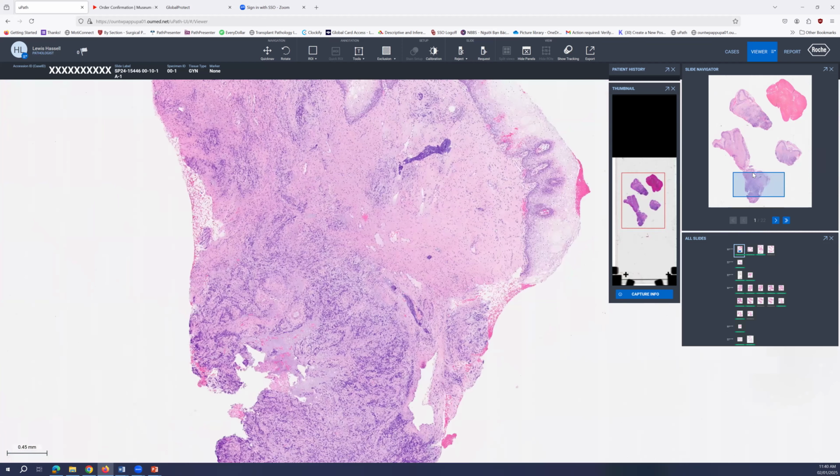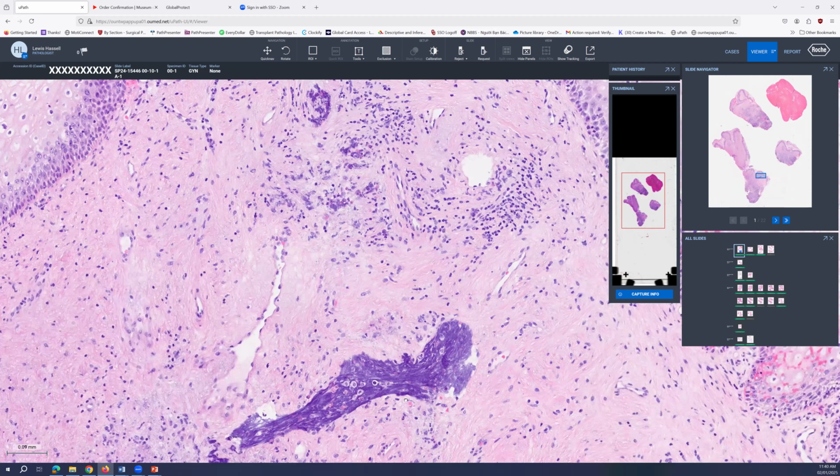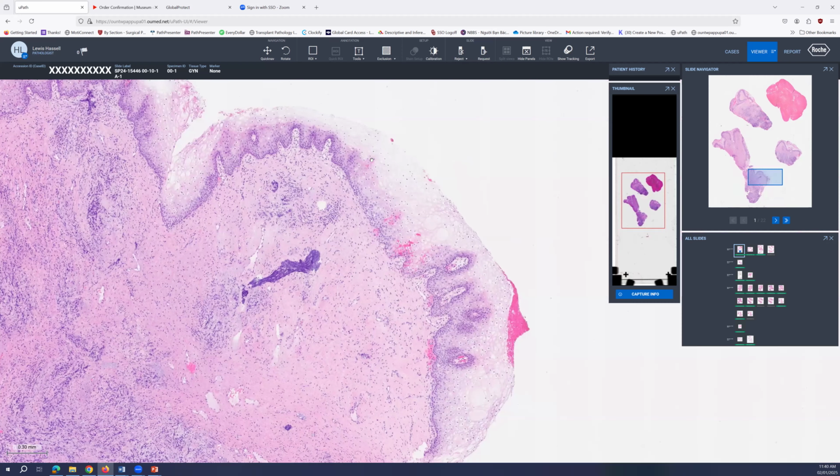So I was kind of stuck with trying to make out what these crushed cells could be. Here you see some that may be up in a vessel or something of that sort, and a few small cells here, just very crushed. So they're obviously very fragile cells and not particularly staining well.